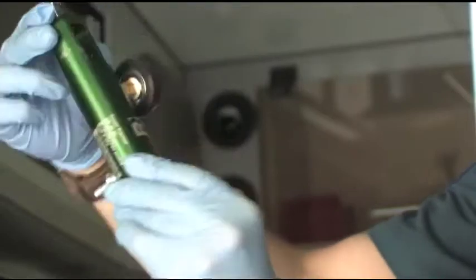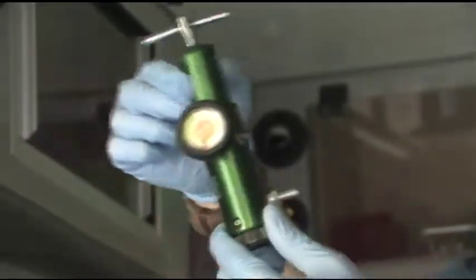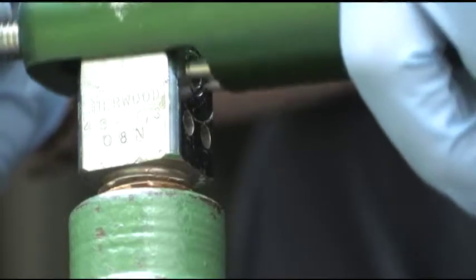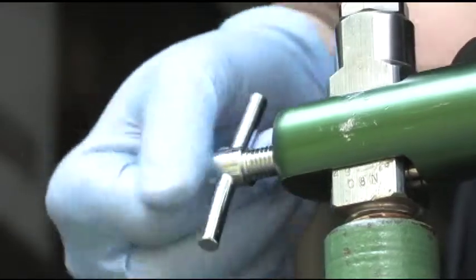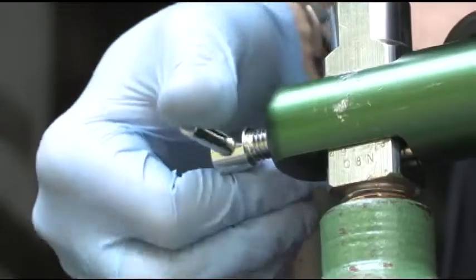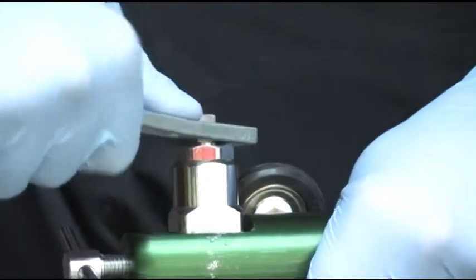Select the correct pressure regulator and flow meter. Make sure the pressure regulator is closed. Then, place the cylinder valve gasket on the oxygen regulator port. Now, align the pins on the regulator's yoke, or thread by hand, so that they fit into the spaces on the tank's valve. Hand tighten the T-screw on the pin yoke of the oxygen regulator, or tighten a threaded outlet with a non-ferrous wrench. Place the oxygen key on the tank valve screw.